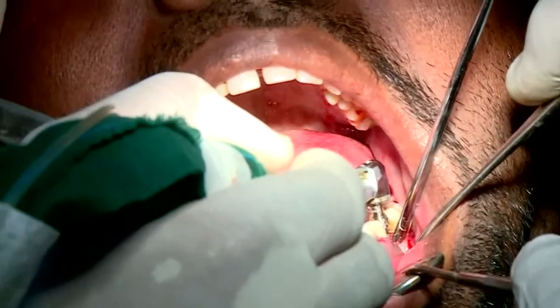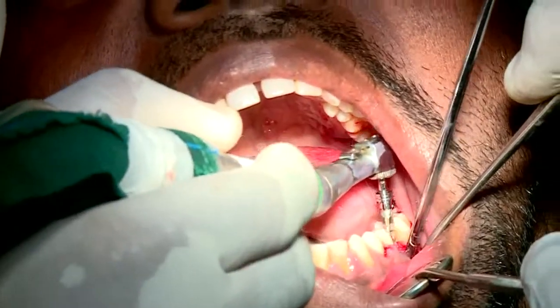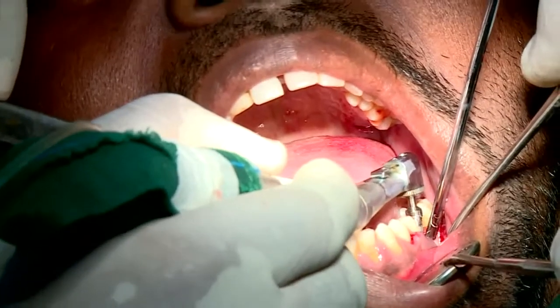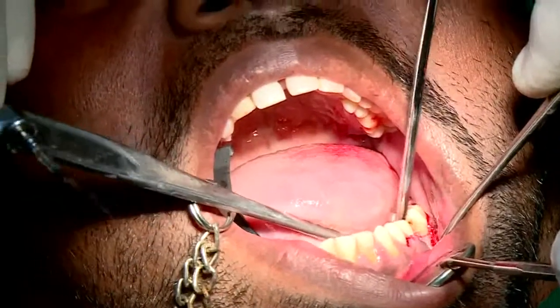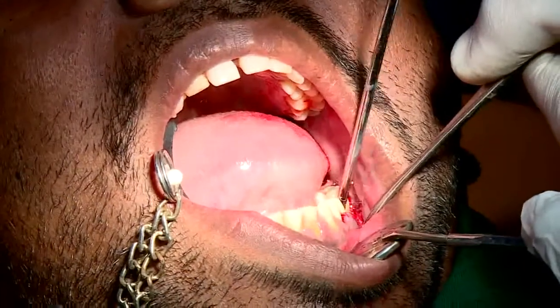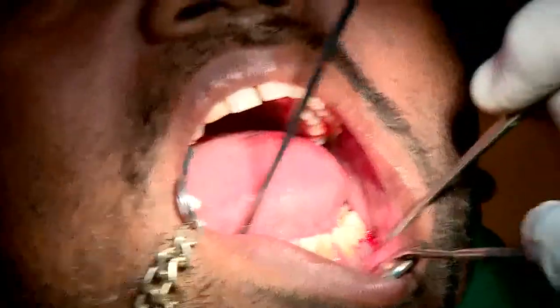And suppose we are going to place multiple adjacent implants, then the space is a little more, around 2 to 3 mm. If you follow these guidelines, you will be able to place the implant in a predictable position. As I was just discussing in the study about the amount of space that is required, as I told you, you need a minimum of 8 to 12 mm. 8 to 10 or 8 to 12 is fine.